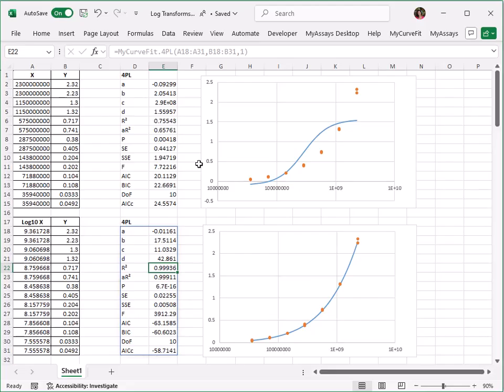And my curve chart appearing to the right-hand side of my parameters shows a fit line that more closely models the calibrator data. I've created this curve chart using a logarithmic plot data table. For more information on how to create this chart, please see the associated video.